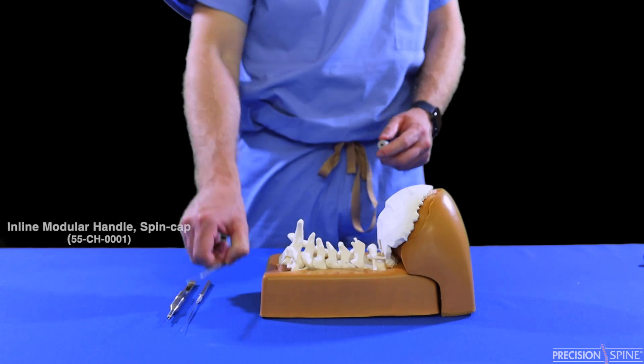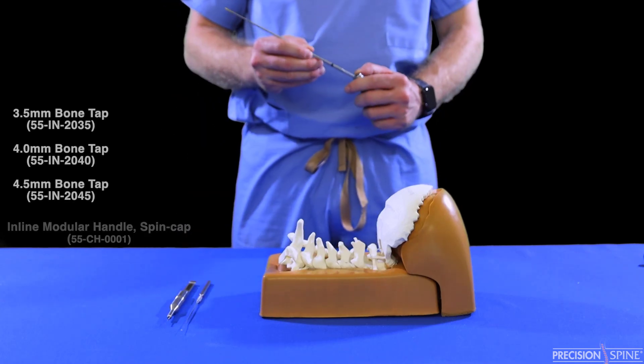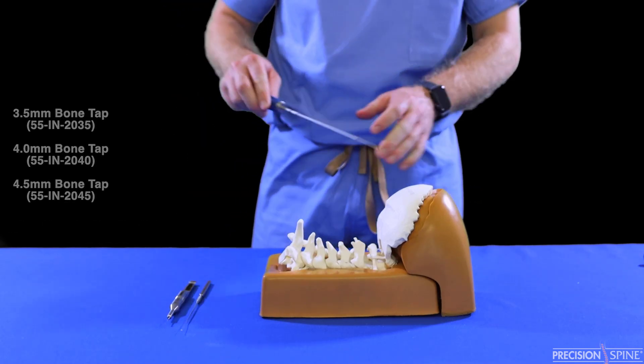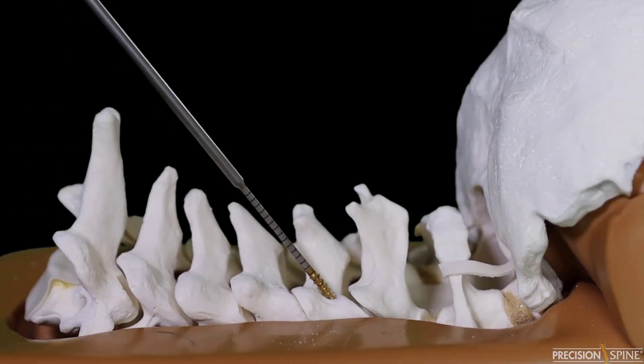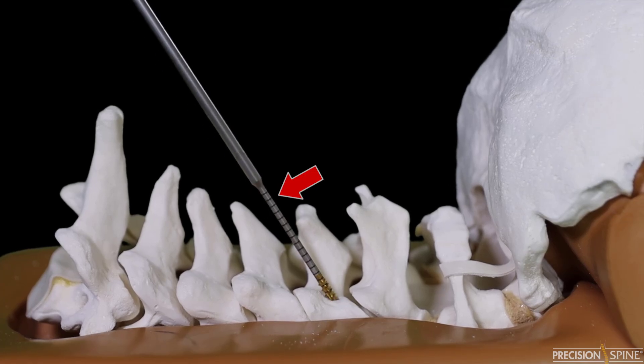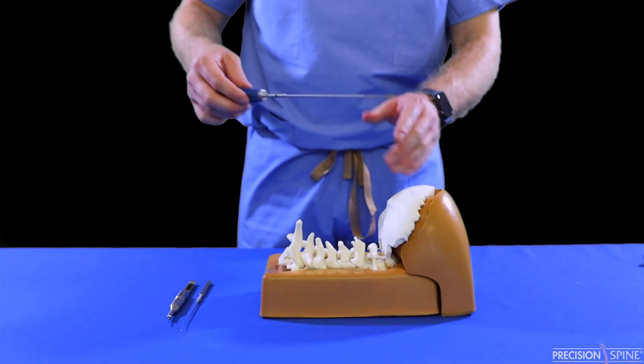Now select the appropriately sized bone tap. While tapping, note the laser etching on the side indicating depth. All taps are 0.5 undersized.